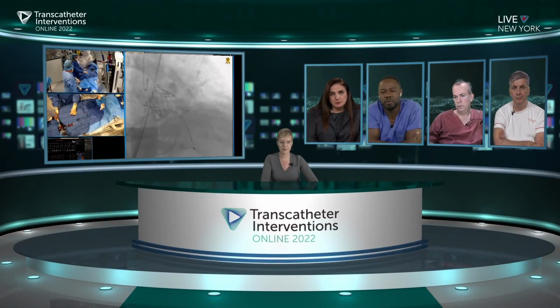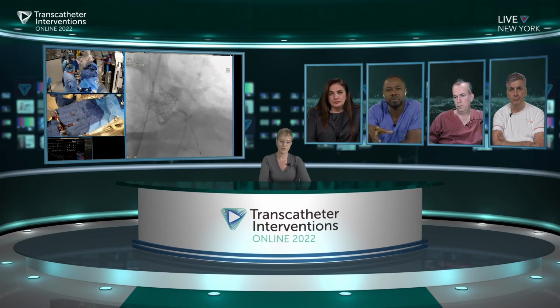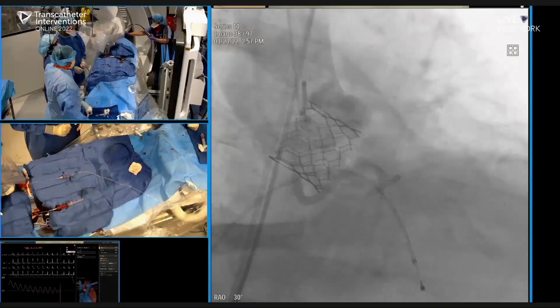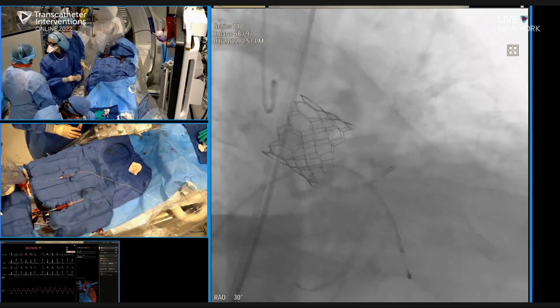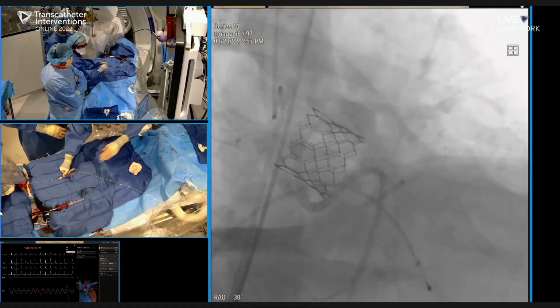So I would say no. For low-risk patients and low and intermediate risk patients, we should leave the OR with 0 regurgitation because we know that we can achieve that, even for bicuspid. And I agree, if the patient was younger, I would go a bit more aggressive because we were in the borderline zone between 2 valve sizes, 29 and 26, so we have to make sure that the device reaches at the maximum 26. And if Becky can just measure the stent frame, it must be close to 24 something. So in a younger patient, I would be slightly more aggressive just to get the maximum expansion of the device.